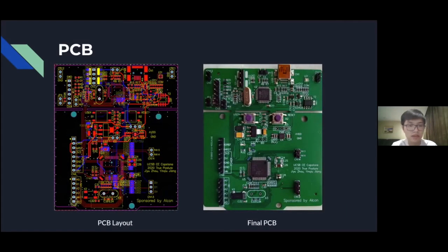This is the PCB layout and the final PCB. The top part of the PCB is basically used for power supply and data transmission. The lower part of the PCB, we expose all the pins we need: the software debugging pins, power supply pins for the EMG sensors, ground pins, and analog input pins.